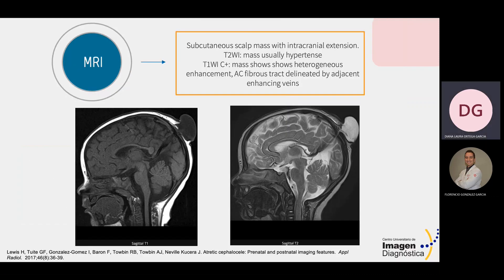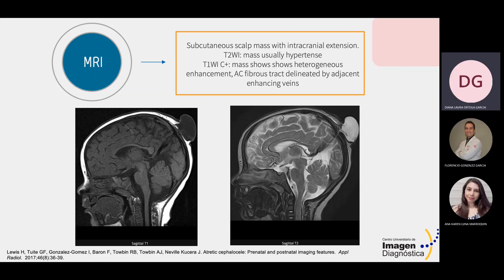On MRI, we see the same mass characteristics. T2-weighted MRI brain images show a mass with high signal and low signal on T1-weighted images. When contrast is used, the mass shows heterogeneous enhancement with the fibrous tract outlined by adjacent enhancing veins.